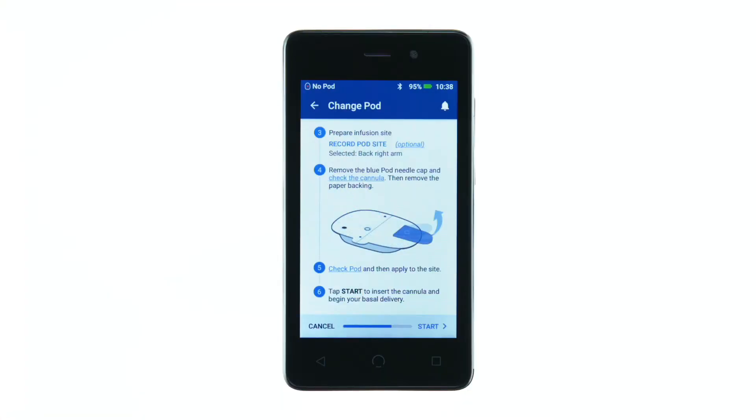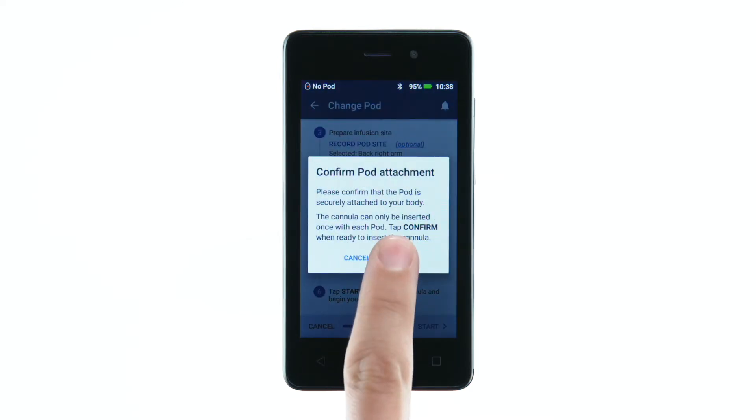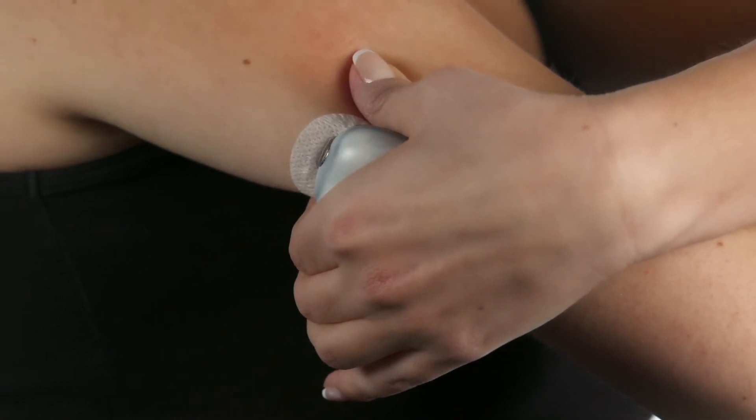When ready, tap Start on the PDM and then tap Confirm. Within a few seconds, the virtually pain-free cannula insertion will occur.